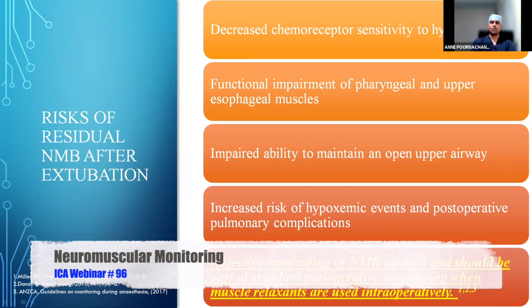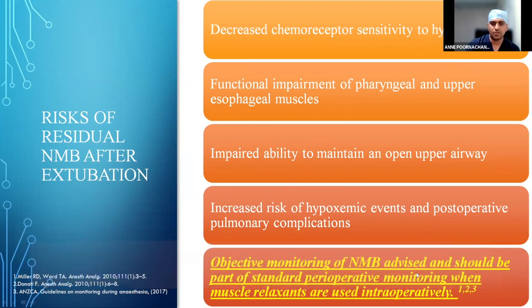Therefore, the Societies of Australia and New Zealand and Great Britain and Ireland suggest that objective monitoring of neuromuscular block be advised and should be part of standard perioperative monitoring, especially when we are using muscle relaxants.